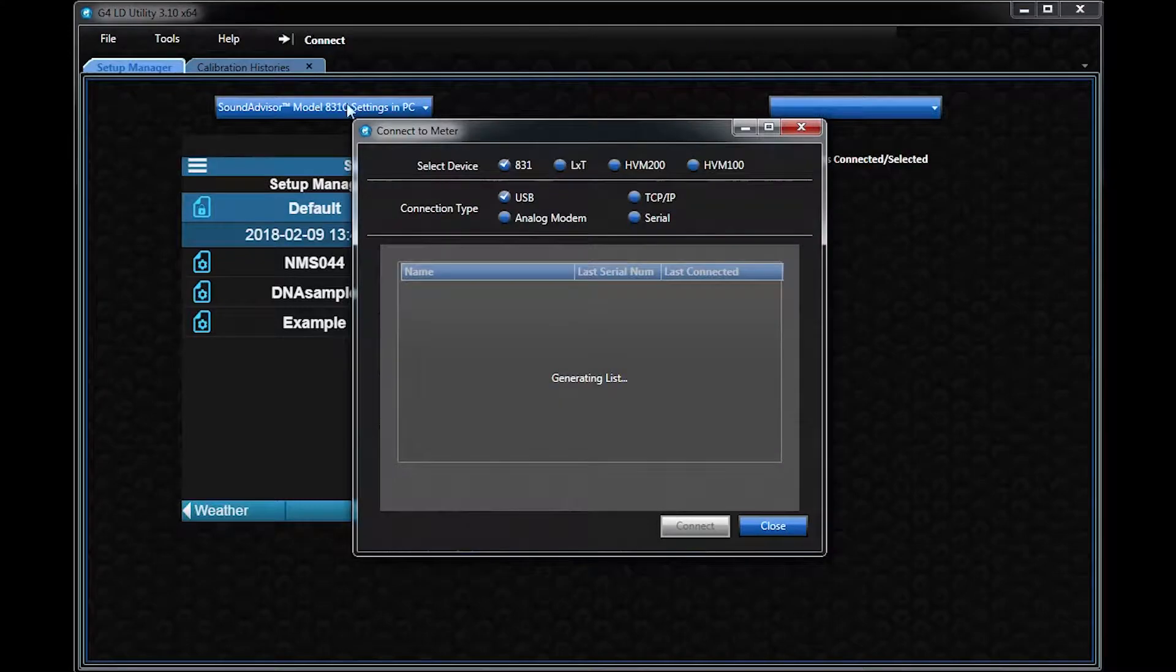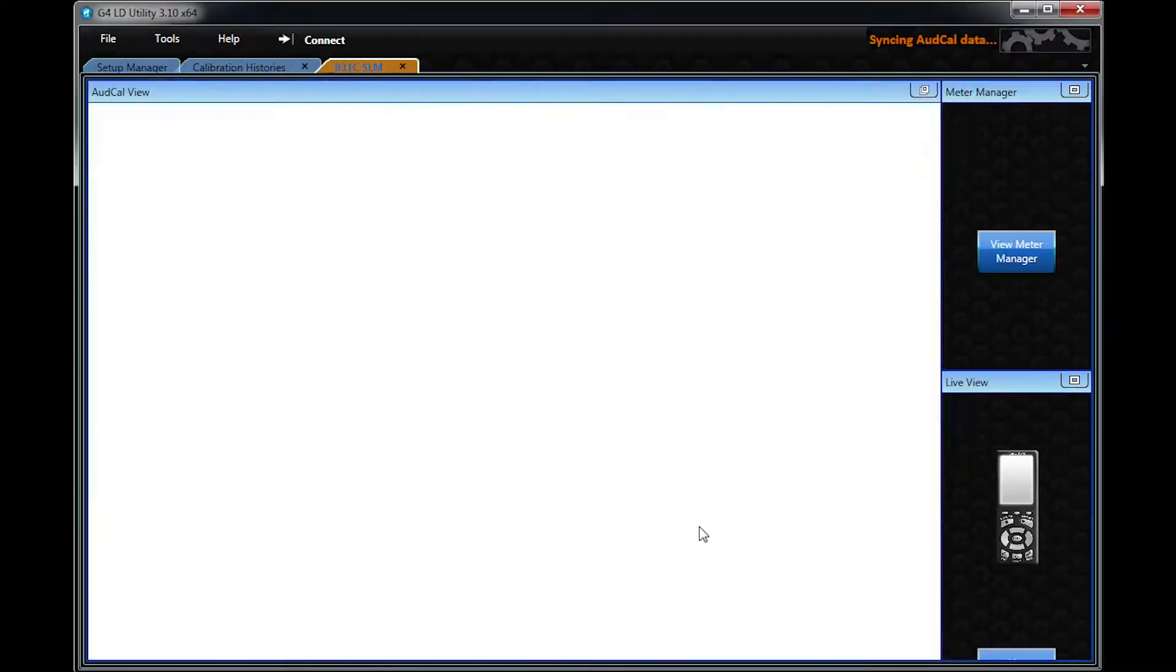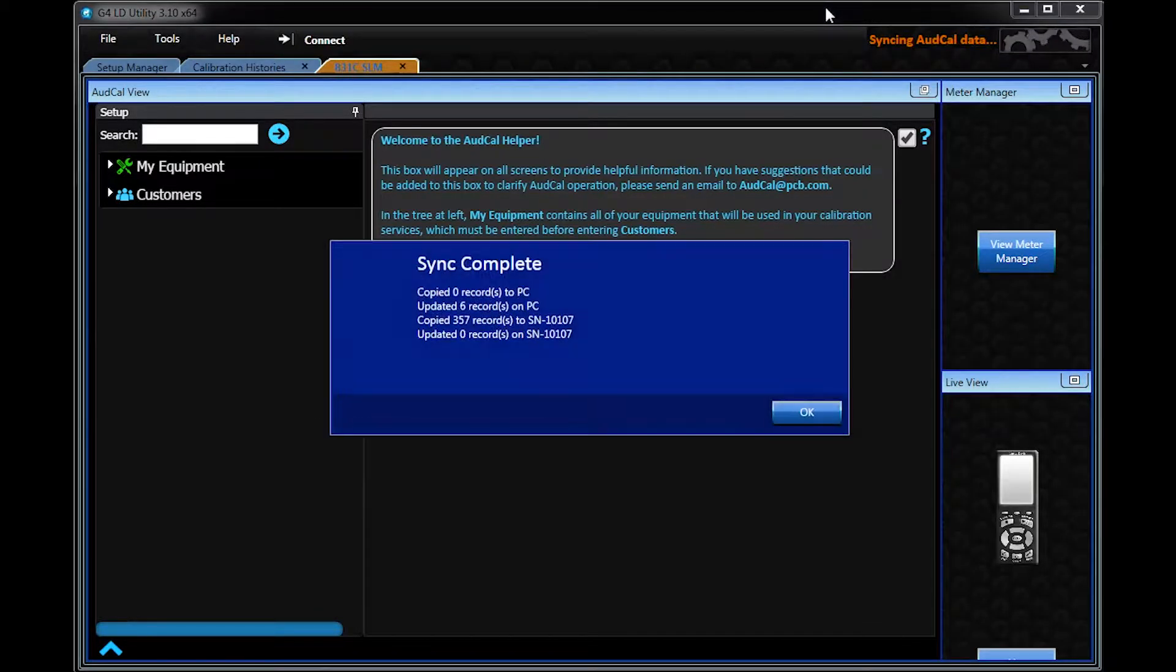Additionally, this database can be synced to a file, an LDOD file, in G4-LD Utility.